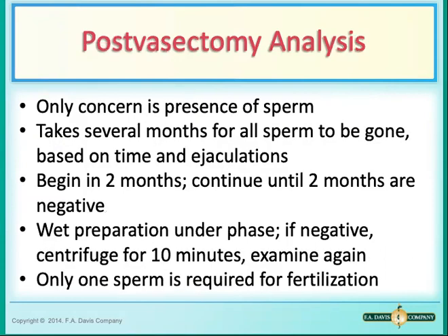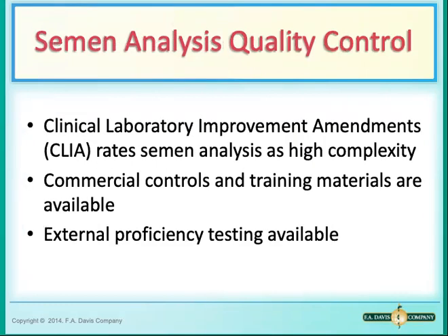And here, again, the only concern with post-vasectomy is the presence or absence of sperm. Remember that only one sperm is required for fertilization. So for post-vasectomy samples, it is very important that we begin the evaluation at 2 months post-vasectomy, and that we continue until 2 consecutive monthly specimens show no sperm whatsoever.